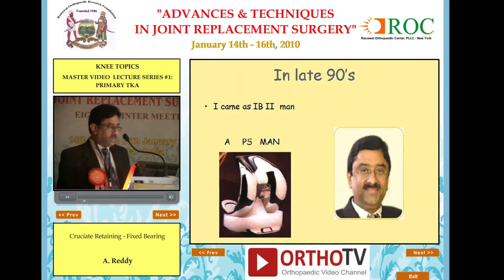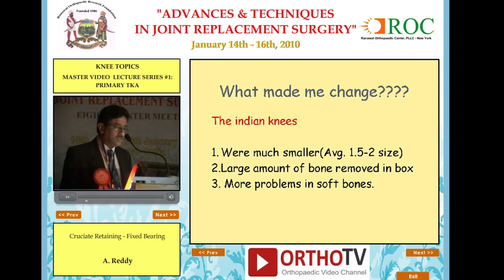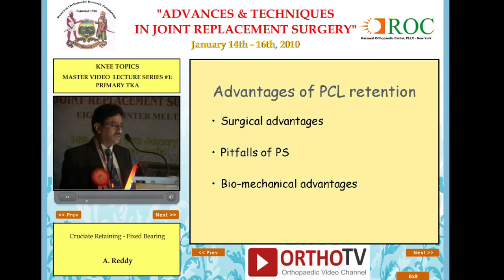Yes. Okay. So basically, I started the knees in the 90s, and I came as a posterior stabilized man at the time. But after coming to India, I changed. What made me change? The knees in India were much smaller, about 1.5 to 2 sizes, and a large amount of bone was removed in the box cut, and there were more problems in the soft bones. So I switched to PCL retention.